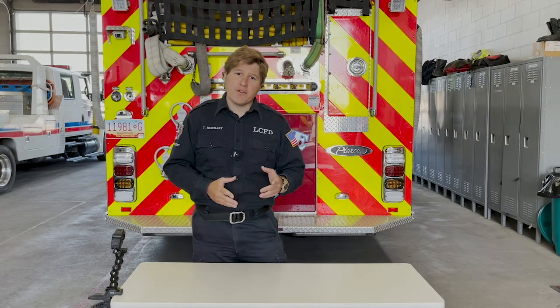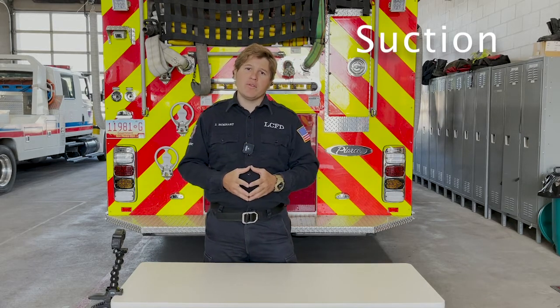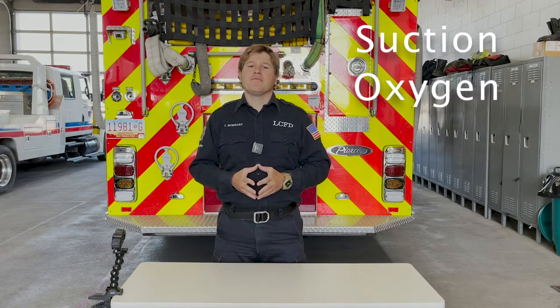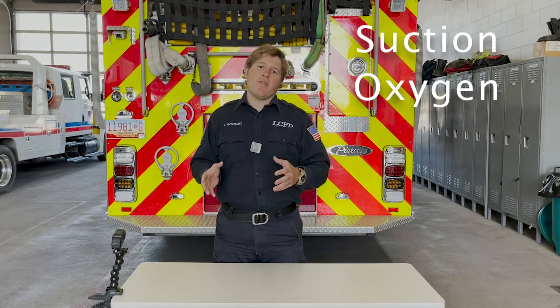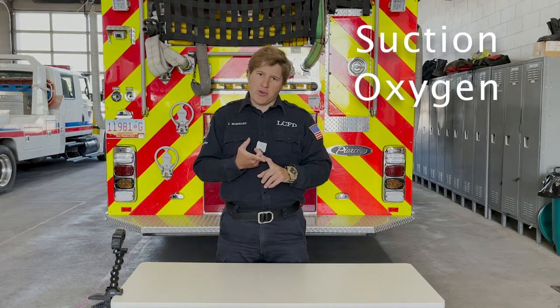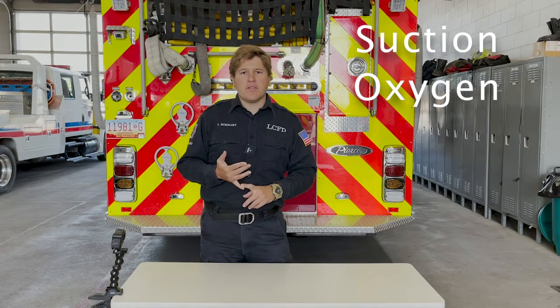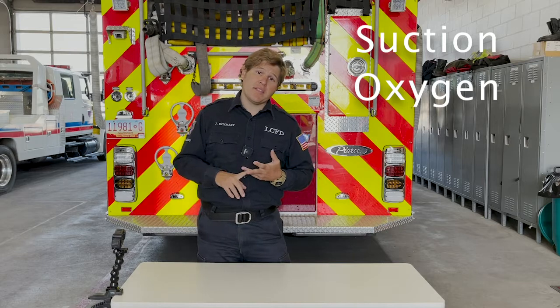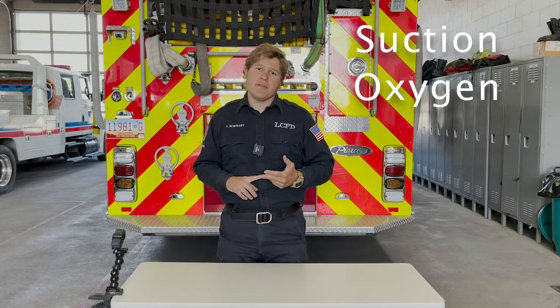So what is SODA? SODA is the acronym that I've used to help me have a systematic approach to intubation. The first is suction, having all those devices ready, and we're going to be going over those. Number two is oxygen. Oxygen is anything supplying ventilatory effort to the patient: your tank, the regulator, your non-rebreather if you're going to use it, or a BVM if you're going to have someone assist you with ventilations. It's also, and a lot of people forget this, preparing end tidal and having that ready to go on the BVM when you perform the intubation.